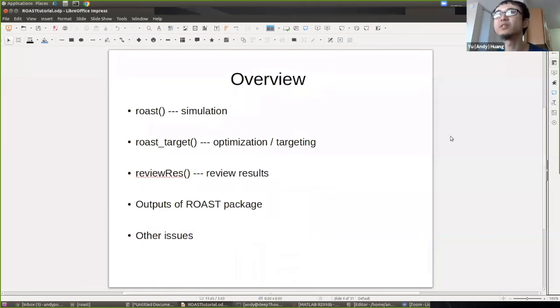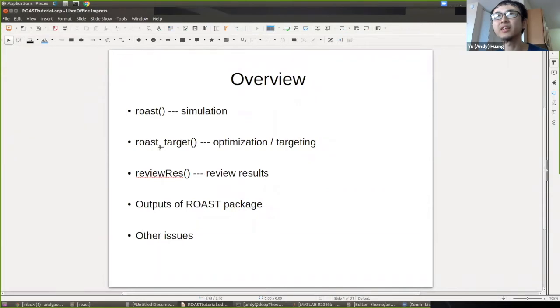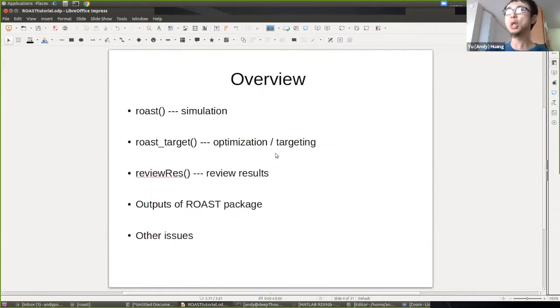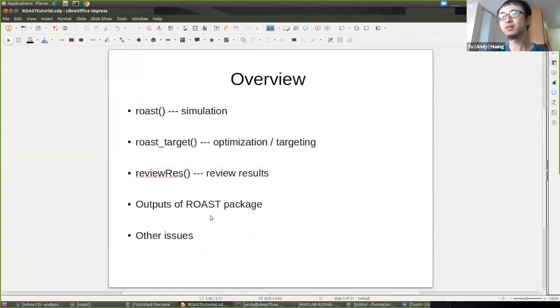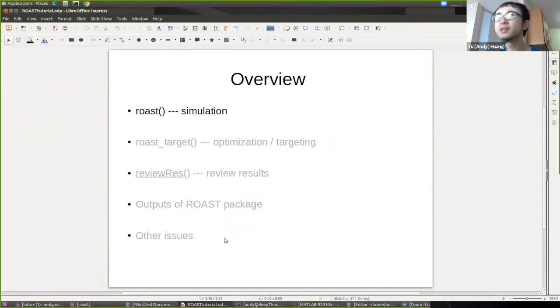This is an overview for the demonstration today. ROAST has three major functions: first, ROAST for simulation; second, ROAST target, for optimization of transcranial electrical stimulation, also known as targeting; and third, once you've done a simulation or targeting, you can use the function review ROAST to review all the results. I'm also going to talk about detailed outputs from the ROAST package and mention some other issues.